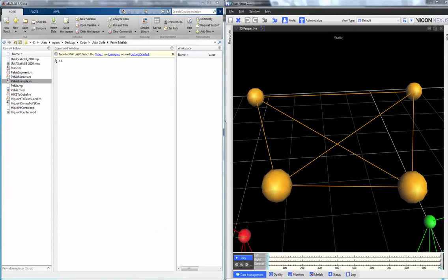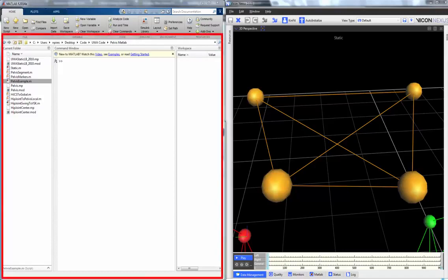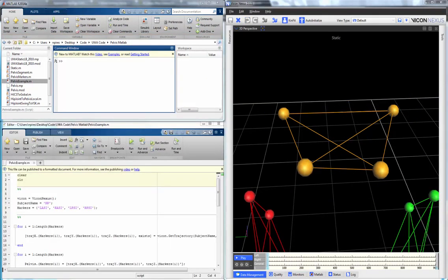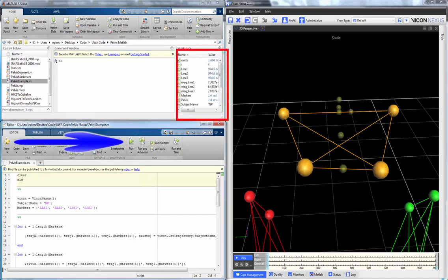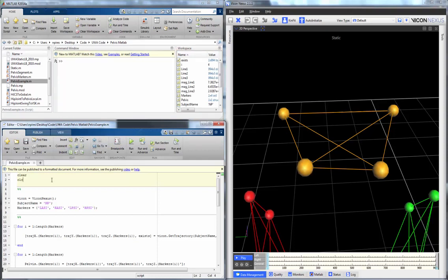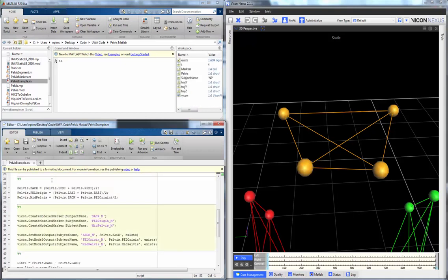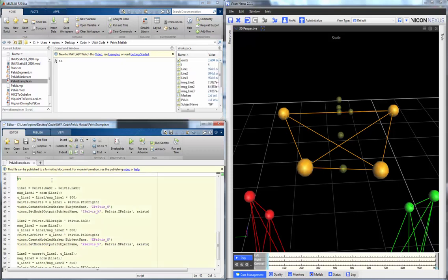You don't only need to execute MATLAB scripts through Nexus. You can execute the script directly through MATLAB itself — one way is through the command window, another is through the script editor by pressing the play button. One useful approach when writing scripts is to execute cell by cell by pressing Shift, Control, and Enter. The C3D file is edited in real time as each cell runs.